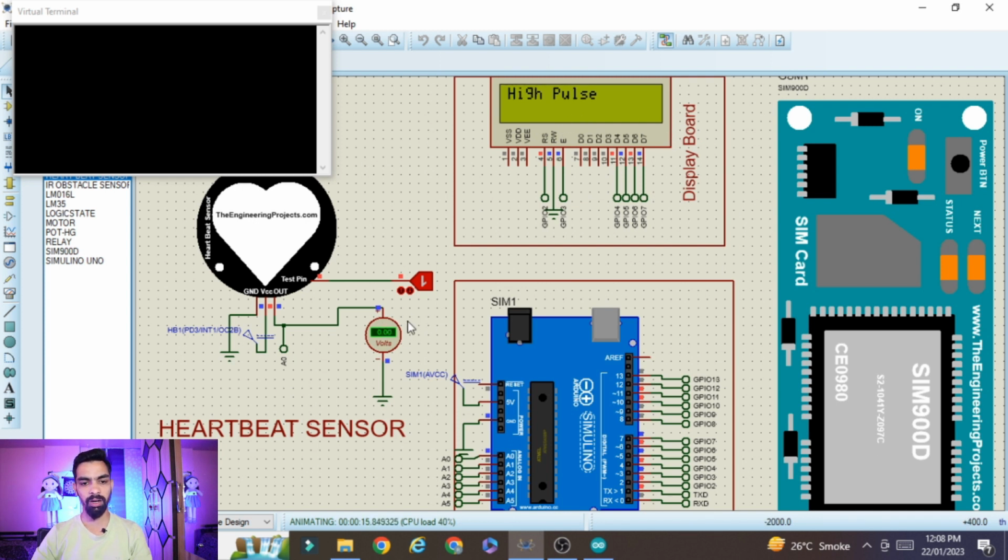So you can see whenever the heartbeat sensor sends the high pulse, you will see 5 volts here. Whenever the heartbeat sensor sends the low signal, then you will see 0 volts here, and that is captured by the Arduino here. You can see 5 volts is sent right now, high pulse is detected, again 0 volts is sent by the heartbeat sensor. Now after some time a low pulse will be detected here. You can see low pulse. So this is the logic. Wait for 10 seconds. So approximately at 23 seconds you will get the final count.